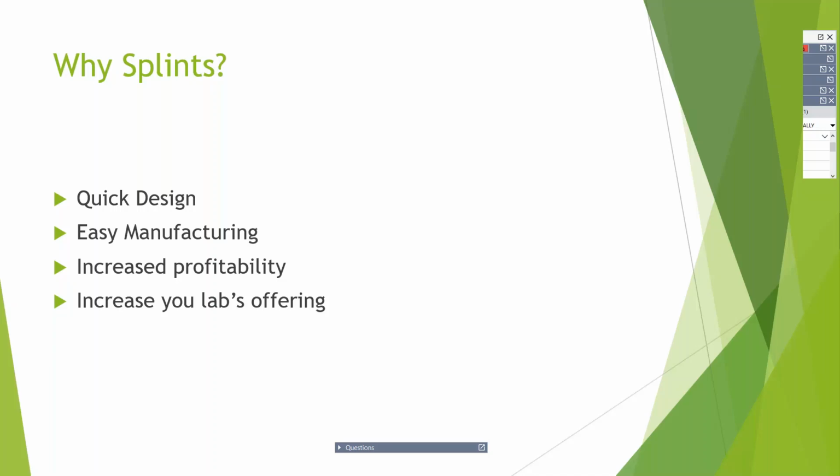The next reason that you might want to consider splints is the ease of manufacturing.